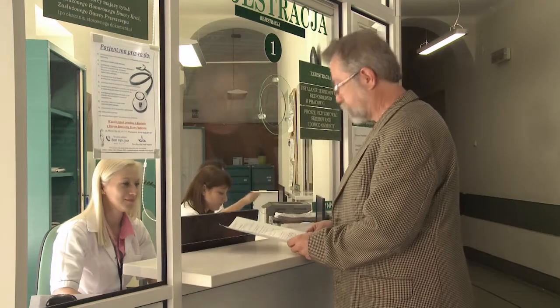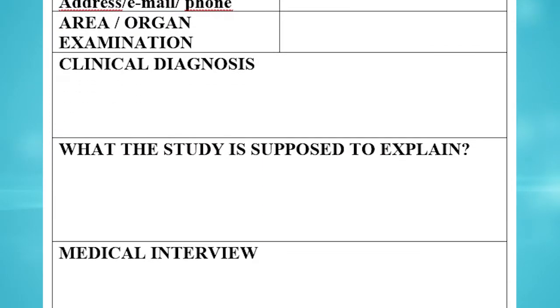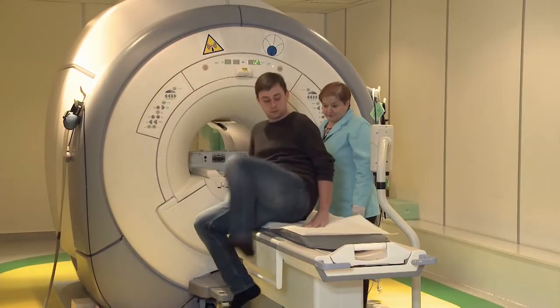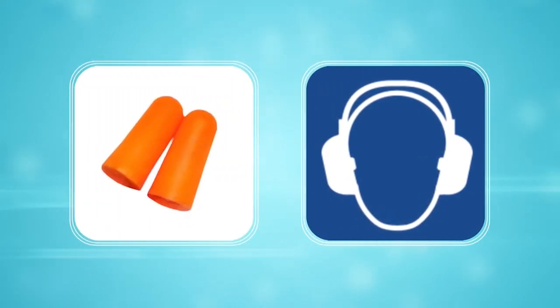To have a magnetic resonance examination performed, a patient should present a referral issued by an authorized physician. During the examination, the patient is lying on a special table which is placed inside the scanner. The patient receives earplugs as a protection against the noise produced by the scanner.